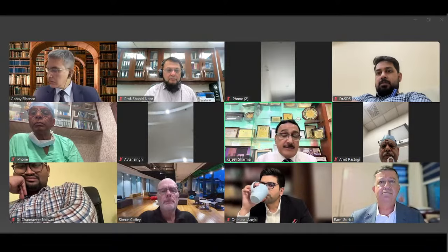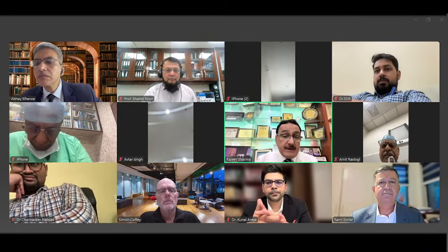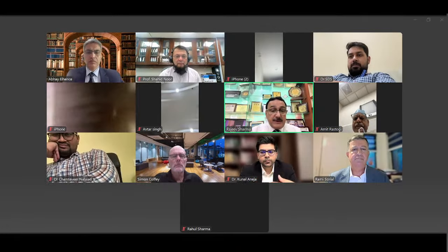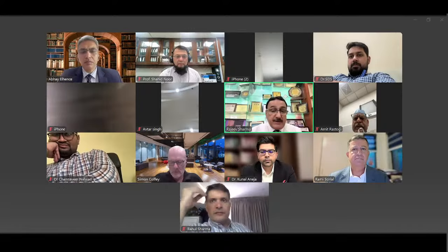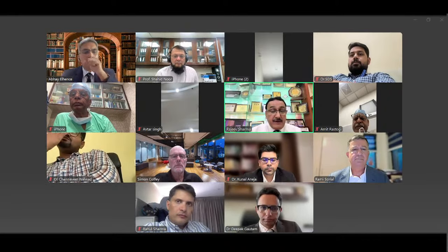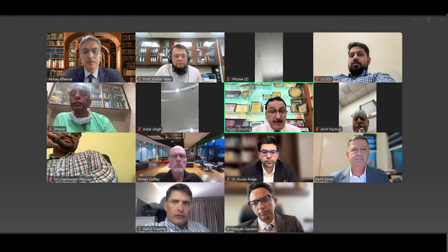Yeah, Simon, if you have the coxa deformities, or if you have the deformities in the distal part of the femur, you need to have the assessment accordingly. And the stem choice is very important, and it has to be dependent upon the bony morphology, the femoral morphology. If you have a dysplastic hip, I'm sure that we'll have to have the arrangement for the small cups and small femoral stem.